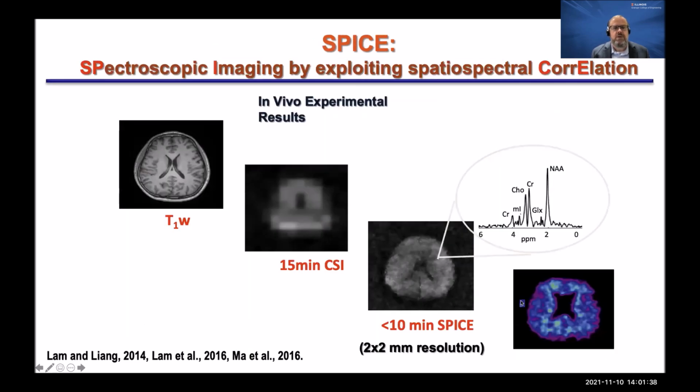Here's another example, the spectroscopy imaging I was talking about before, where for each pixel we're trying to look at the chemical information in that pixel. And we need to take a really long readout to look at all these very closely spaced frequencies along that dimension. Well, this is also a low rank signal. The underlying structure of the brain is very much shared between them. And we have just a few components, a few different chemicals in there. And so it's really easy to understand that this is just a mixture of several functions there.